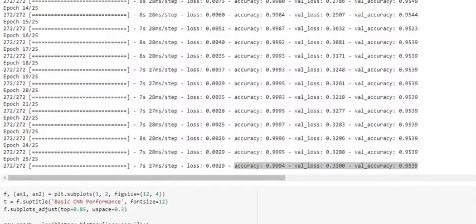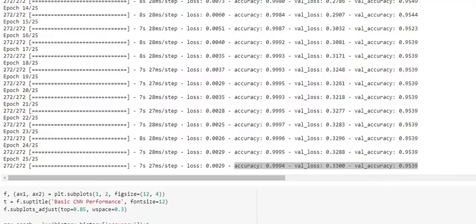After training this model, we get a validation accuracy of 95% and it looks to be slightly overfitted, looking at our training accuracy, which is 99.9%. For clear perspective, we plot the training and validation accuracy and loss curves.